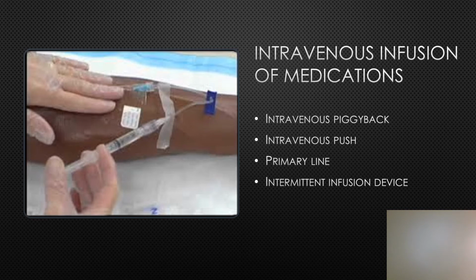Then attach the medication syringe and inject the medication at the predetermined rate. Detach the syringe and cleanse the port. Attach a second saline syringe and inject at the medication determined rate. Remember, you still have medication in the tubing and the catheter, so you don't want to just push the saline in after the medication has been injected, or you will be bolusing the client. Then unclamp the tubing and restart the infusion.